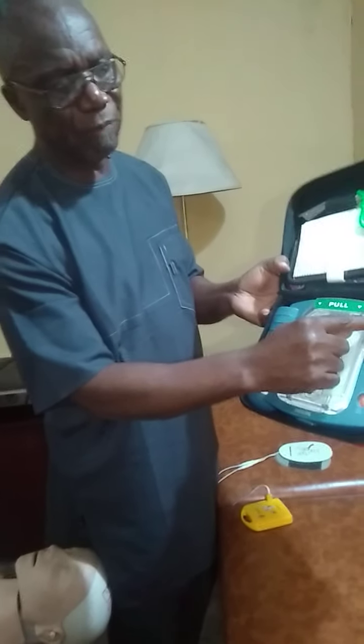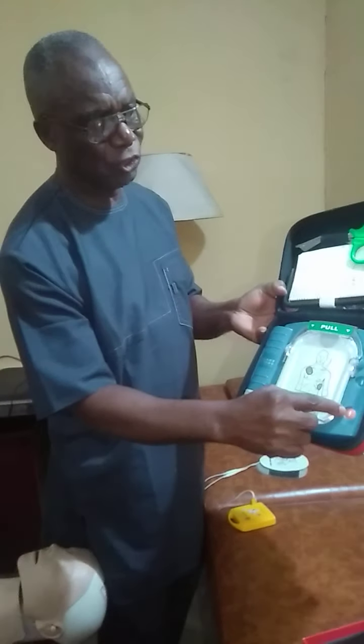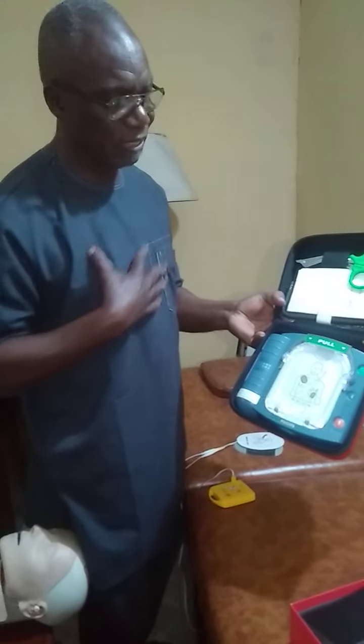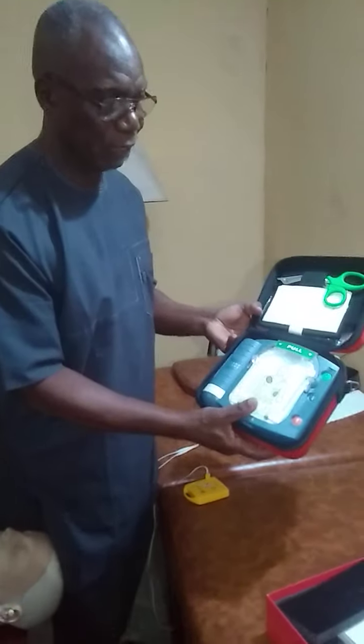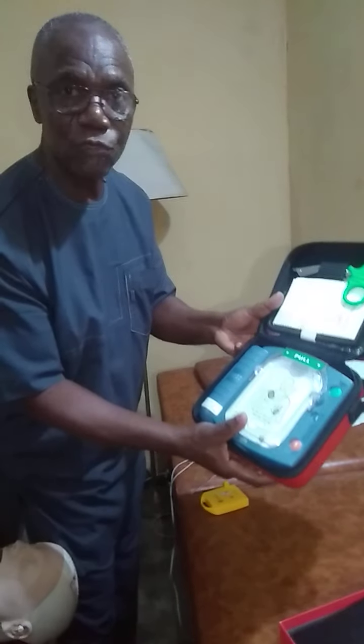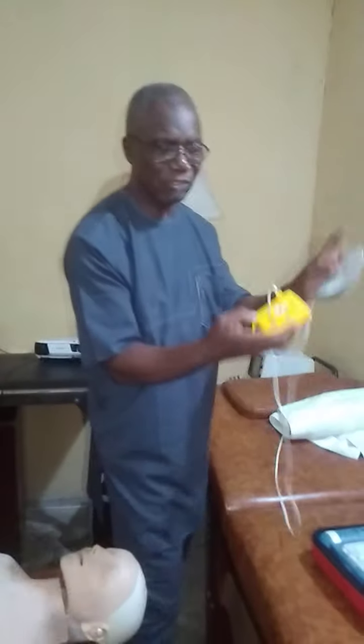This starts the defibrillator. This administers the shock. Now, I have scissors here to cut out the shirt or whatever it is that may be covering the chest area. So this is the complete AED machine. But then I'm not going to use this for the demonstration.